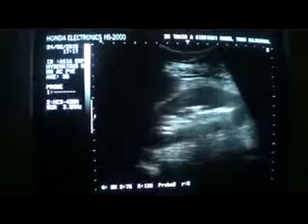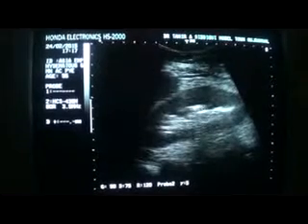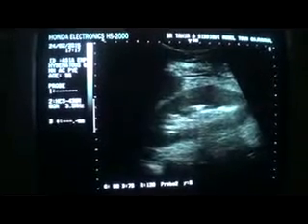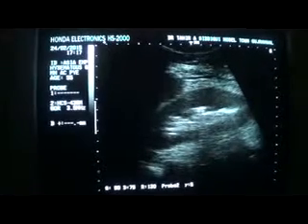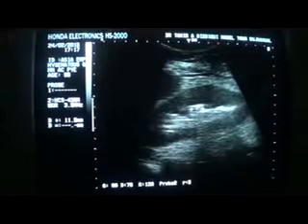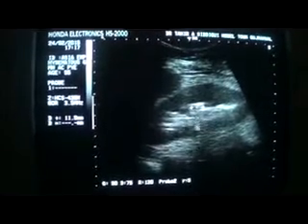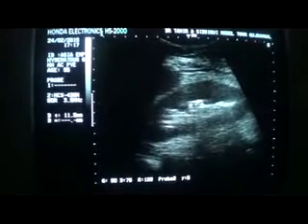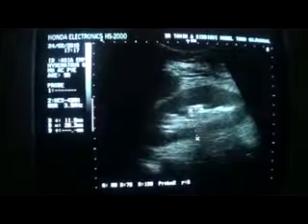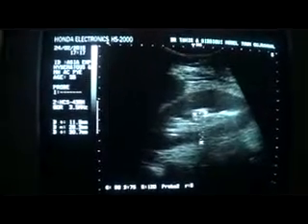And now you see this one. If I show you this intensely echogenic, or in a simple one word, shiny, echogenic linear area measuring approximately 11.5 mm, it is giving a reverberation artifact. You see this one, this is the reverberation artifact seen from it, and this is you can say a comet-tail artifact as well.